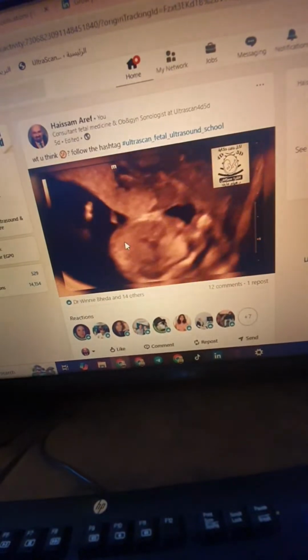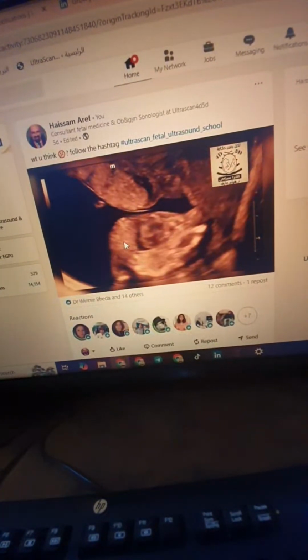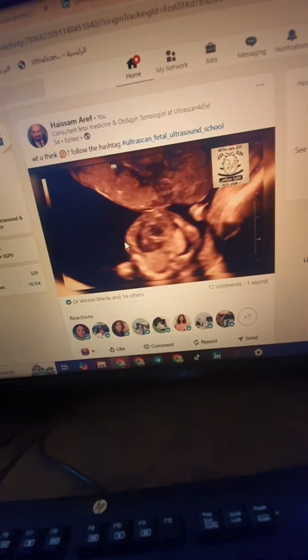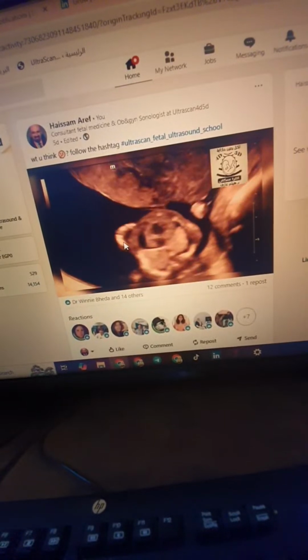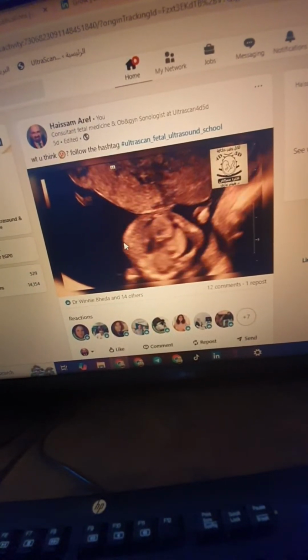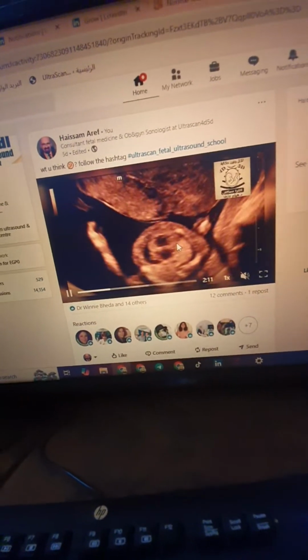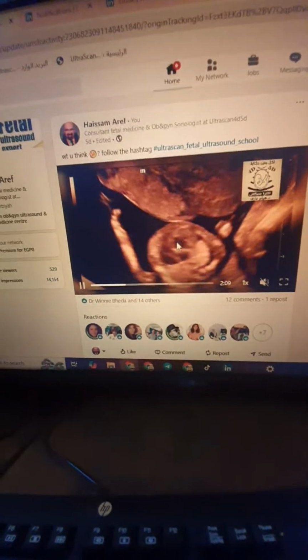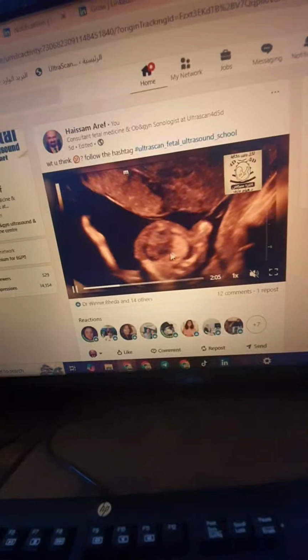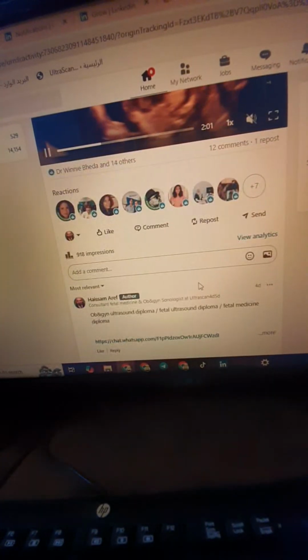But you can almost see that the stomach is on the left side and the heart, the axis, is on the right side, so there will be heterotaxy also, and the effusion that you can see. So it's lethal and the fetus will die in utero. It's a case of double inlet left ventricle. We do have one monoventricle with two atria, effusion, and the heart block, my friends.